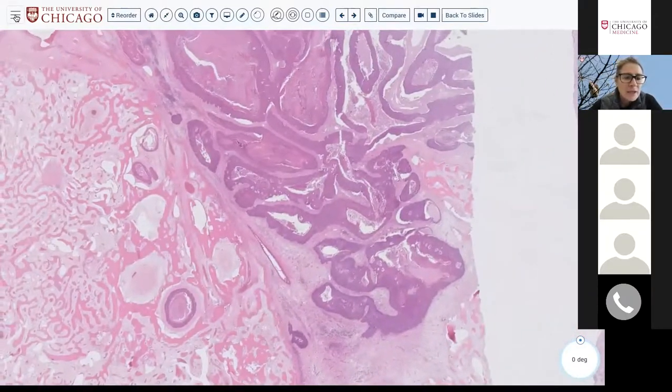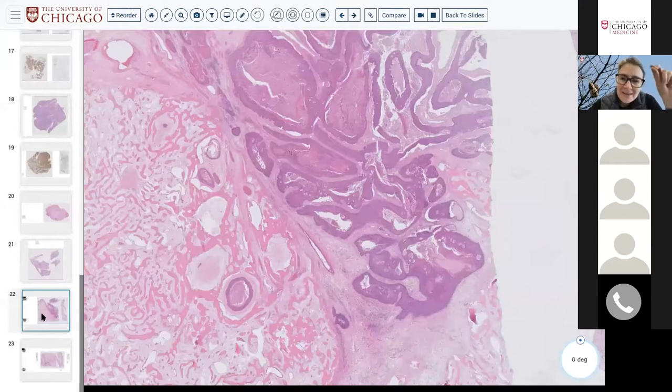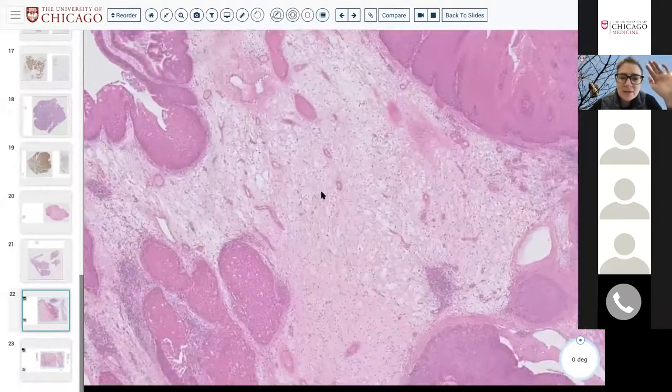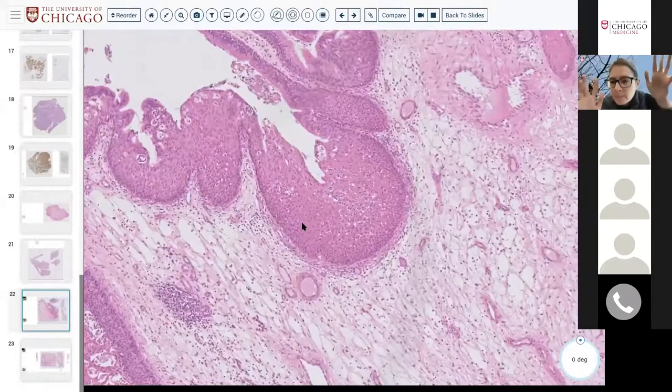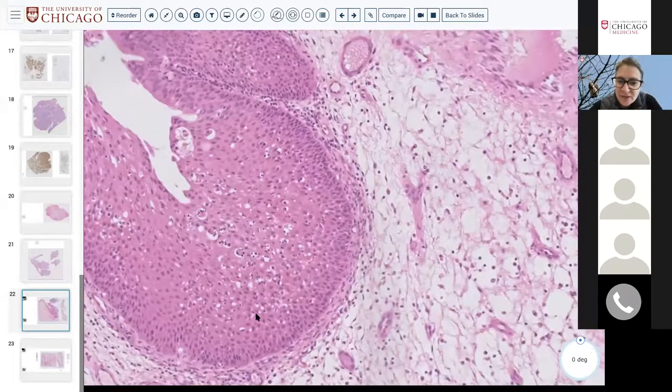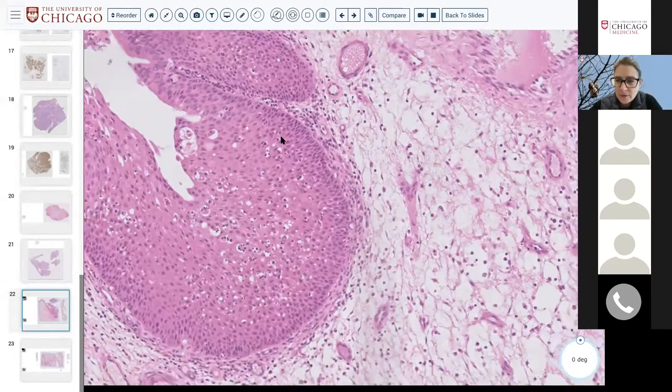So in this case, the relatively benign part of the sinonasal papilloma, as mentioned here, is this thickened squamoid to transitional type of epithelium with little neutrophilic microabscesses, very bland. This is your regular papilloma, all right?